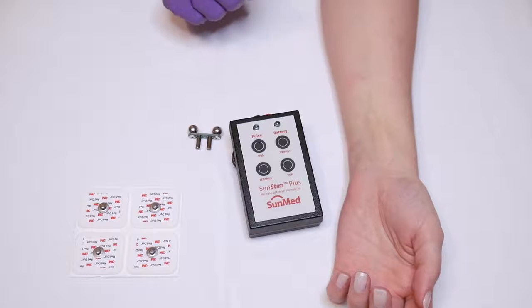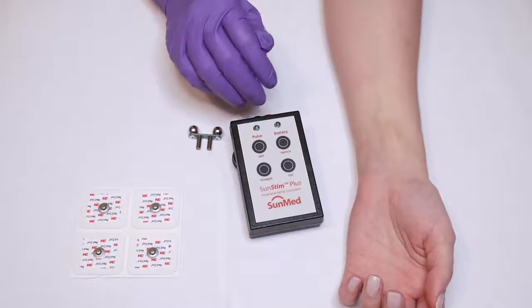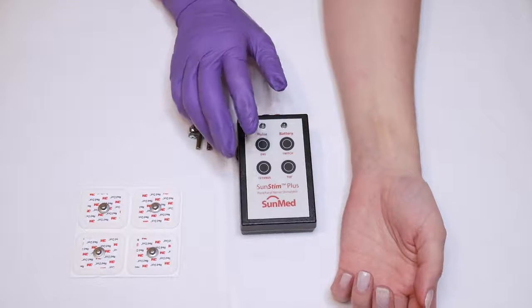If possible, before administering a paralytic on a patient, it is best to get the baseline train of four, as long as it's safe for the patient.